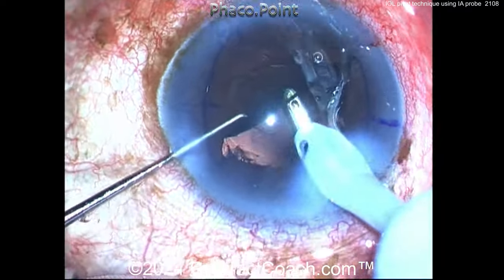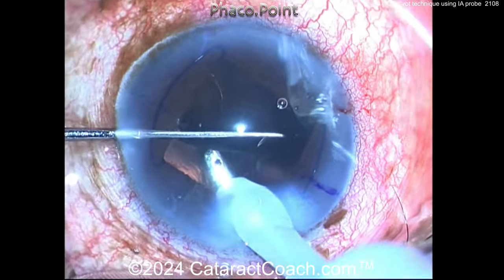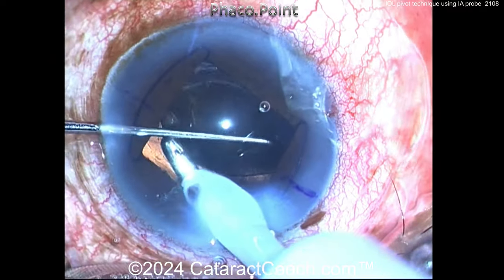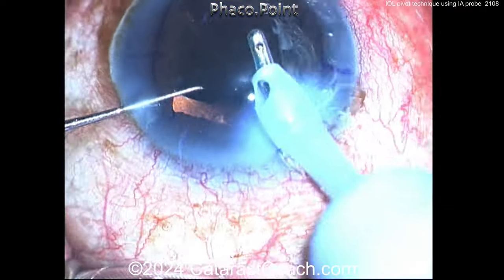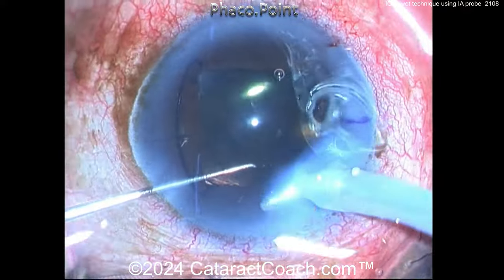Getting the probe under the optic, and now you can rotate the lens wherever you want. It looks like a reasonably gentle technique — not much stress on the capsule or rhexis — getting that lens positioned precisely where you want it. Also a nice way of removing viscoelastic from behind the optic.